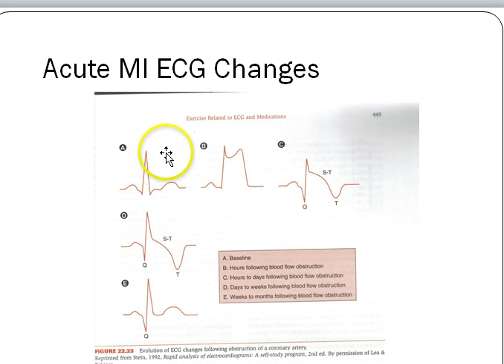So say the last time they had a normal ECG, and then their ECG looked like E. The doctor will say, well, did you have a heart attack? Sometimes people will have a silent heart attack and not know it. So they can tell that you've had a heart attack in the past if your ECG looks like this. They just don't know when. So it's sometime within the last couple years. But that's actually fairly common, that someone could have a small heart attack, survive it, and not know that they had it. But typically if people are having heart attacks, that's often going to be picked up.